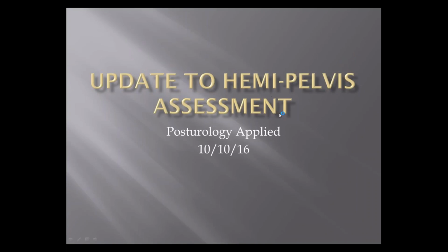I actually had a completely different webinar planned, but we have been finding out that, believe it or not, we may have been making a mistake for a little bit. I know it's shocking that we do make mistakes. And we wanted to get you on board to the most up-to-date way of assessing for this thing called hemipelvis, and actually there's a little bit of leg length that we're going to talk about as well.